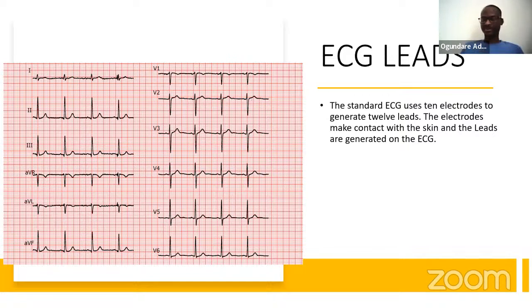I've seen even the so-called experts using leads and electrodes interchangeably. Okay, they are different, and I want you to take that away from me today. The leads are what you can see on the screen here. That's what you see on the paper. There are 12 of them.